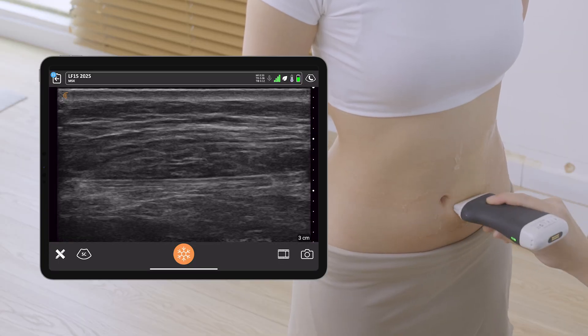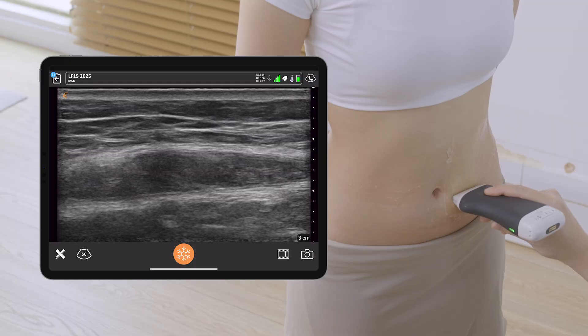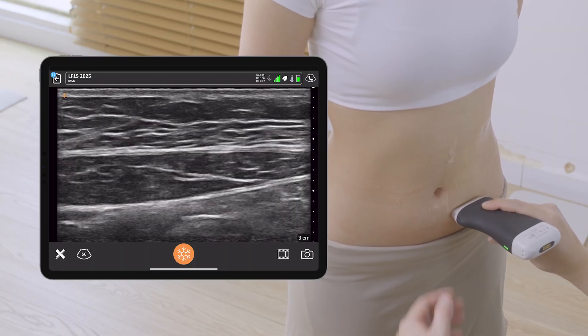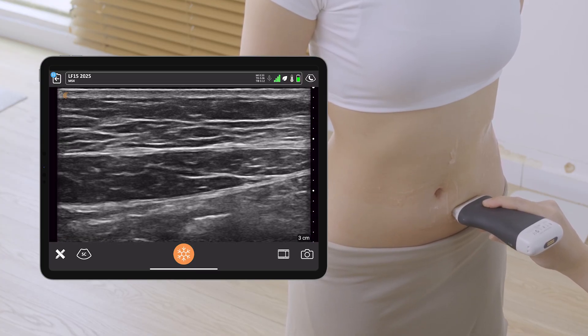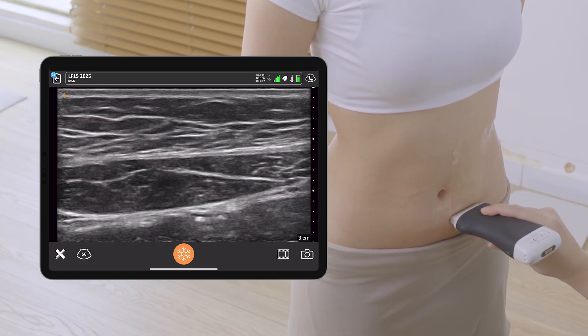I continue my scanning downward and I look at the left rectus muscle below the umbilicus, again at the level of 3cm below the umbilicus on the left side. I do my measurements again, and naturally you will have more fat deposit in this area.